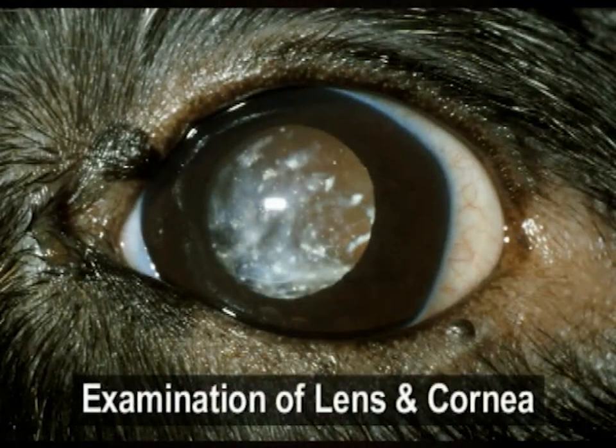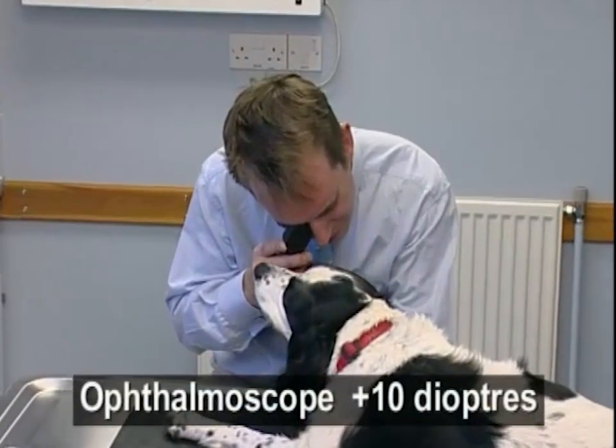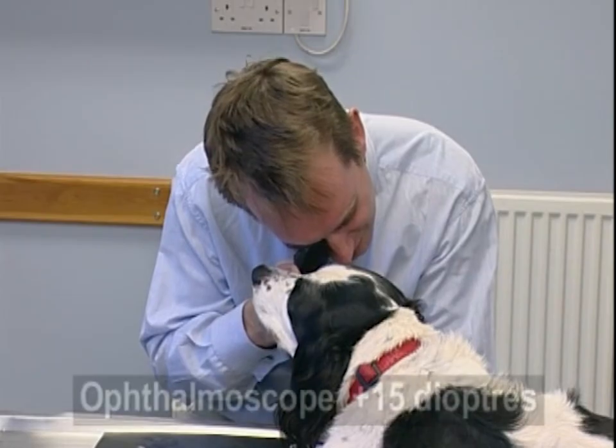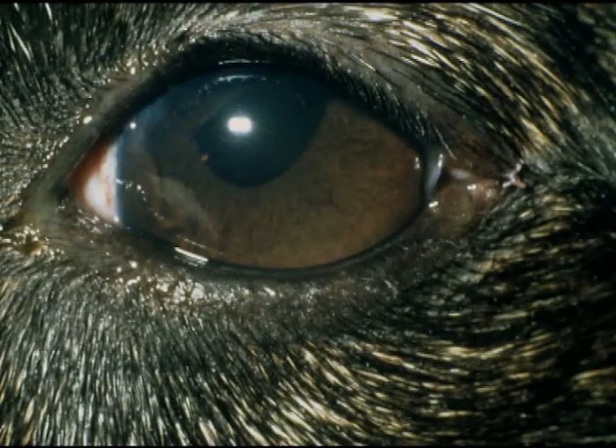The direct ophthalmoscope may also be used to facilitate examination of the lens and cornea. With the ophthalmoscope preset on approximately +10 diopters, the examiner may move closer to the patient until the lens comes into focus. If the setting is altered to about 15 diopters, then the cornea can be focused on in a similar fashion.